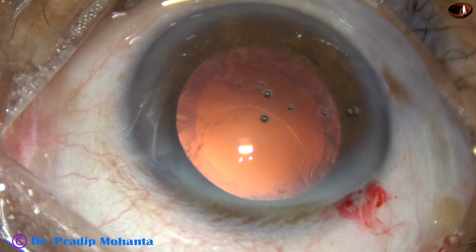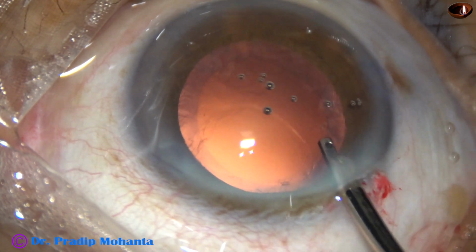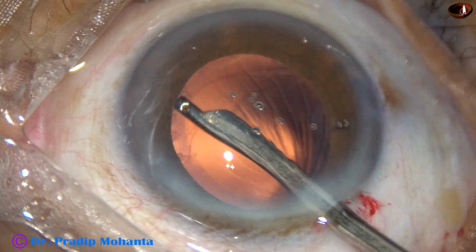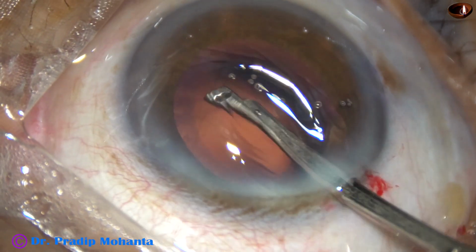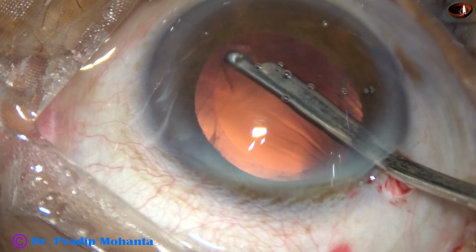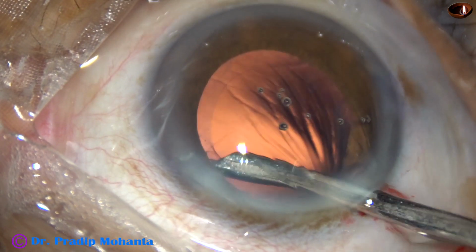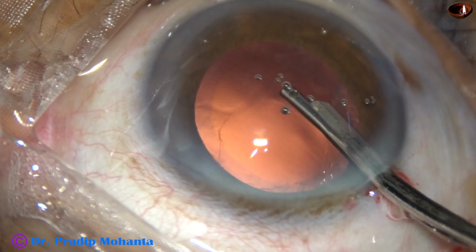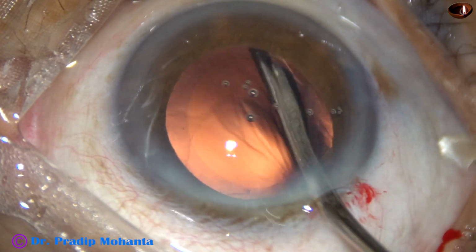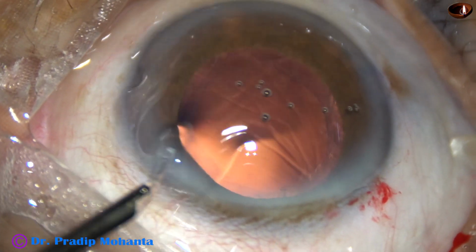And now enough of vitrectomy has been done, and now cortical cleanup will be very easy. You can use anything, bimanual IA or this instrument. This is a 23G Simcoe, because there is no vitreous at these areas now, so cortex will come very nicely. You can see how nicely the cortex is coming, and you can see that I am not pulling any strands. So cortical cleanup is done very nicely.